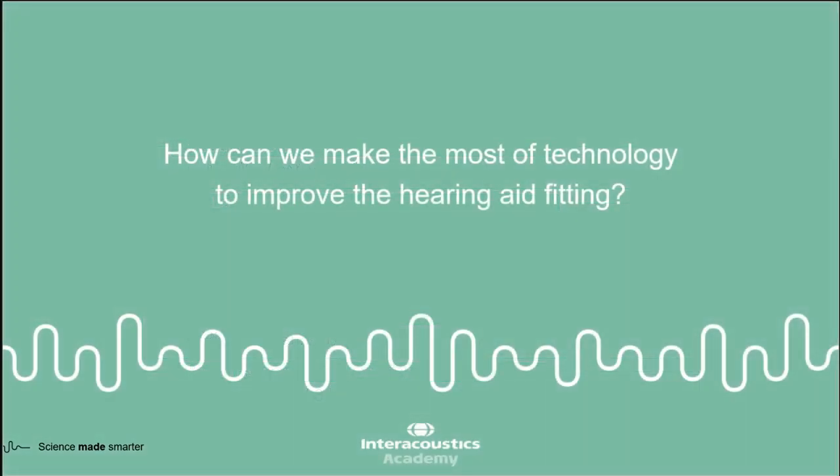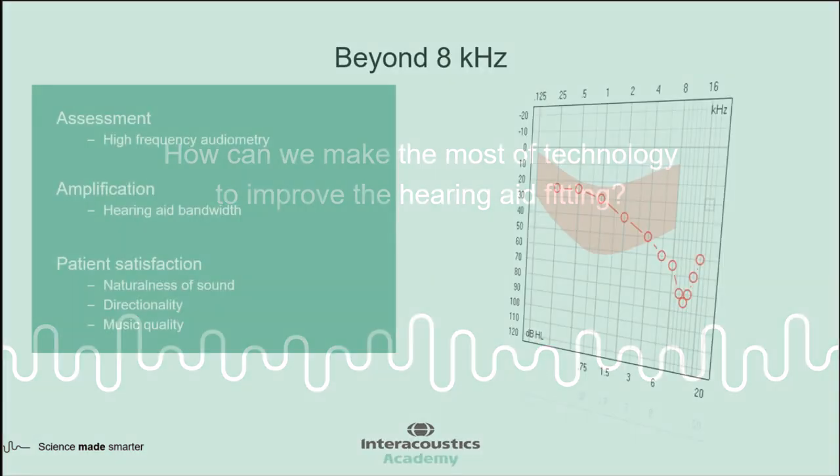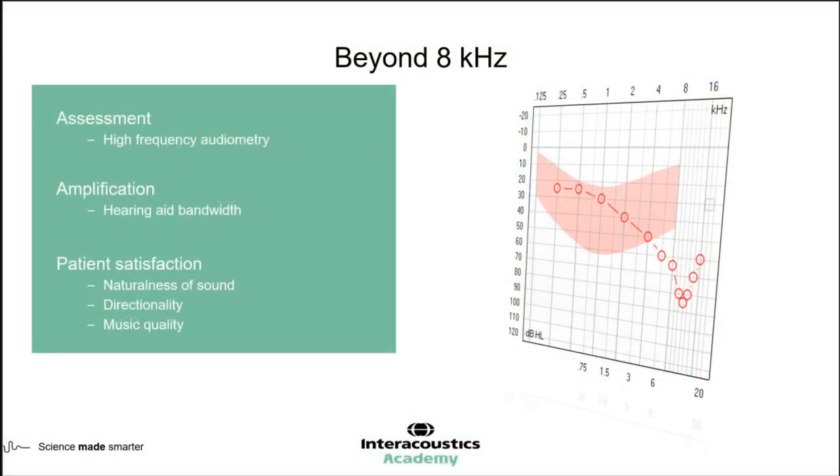Moving on, how can we really make the most of technology to improve the hearing aid fitting? Well, the tests that I've already mentioned are obviously all part of how we use technology at the assessment stage. And I've mentioned high frequency audiometry already. Touched briefly on the importance of high frequency work in terms of hearing aids and amplification, and how the future trajectory is very definitely higher frequencies and how they can work within the hearing aids to best effect.